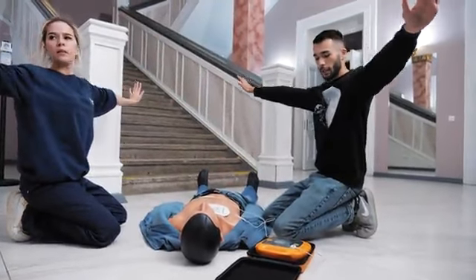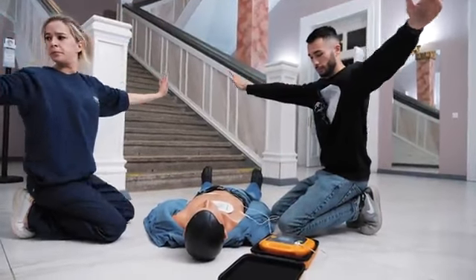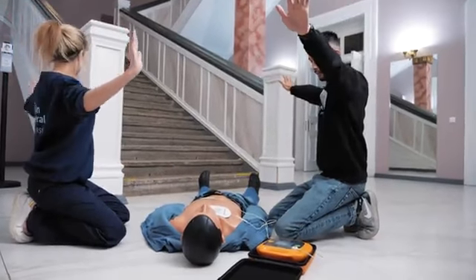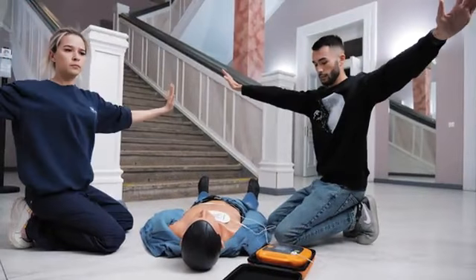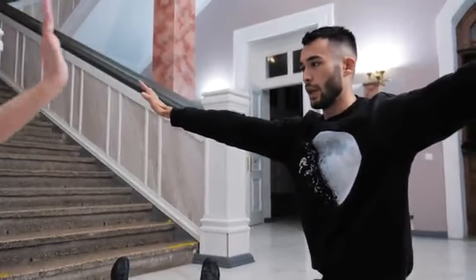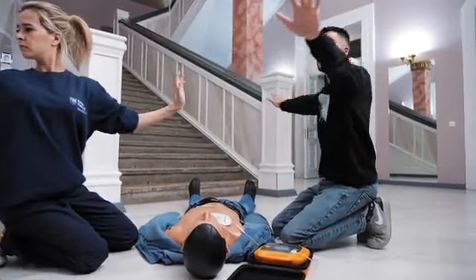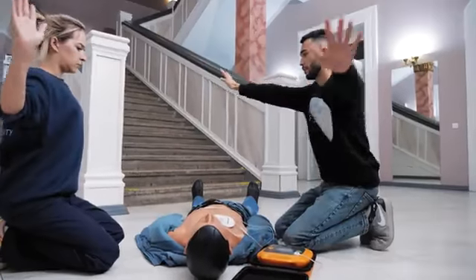Stay clear, everybody. Do not touch the patient. Shock advised. Charging. Stay clear of patient. Everybody stay clear. Deliver shock now. Press the orange button. Shock. Shock delivered.